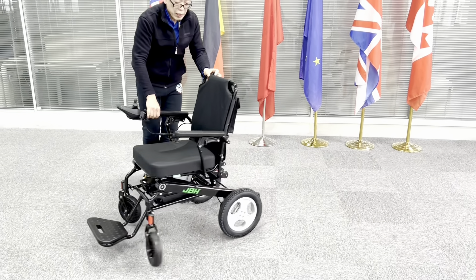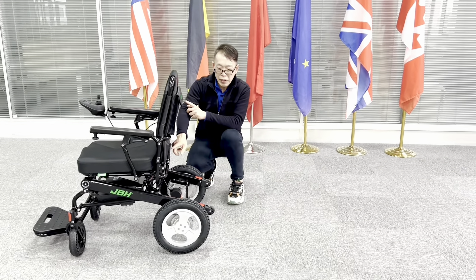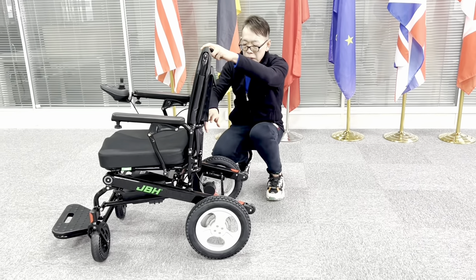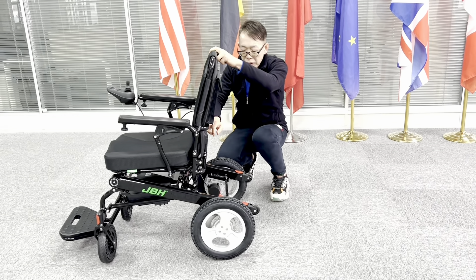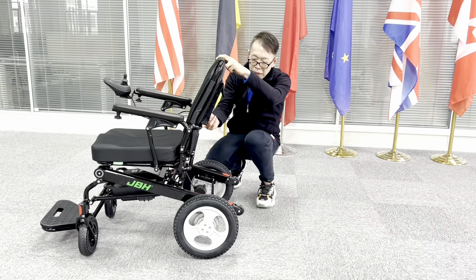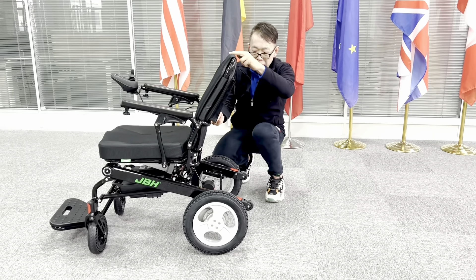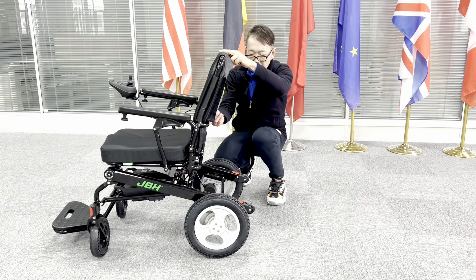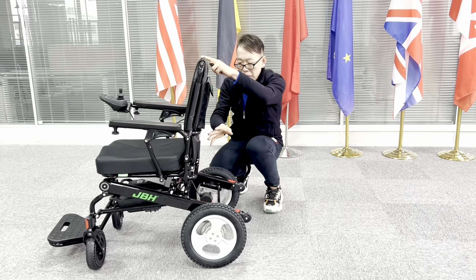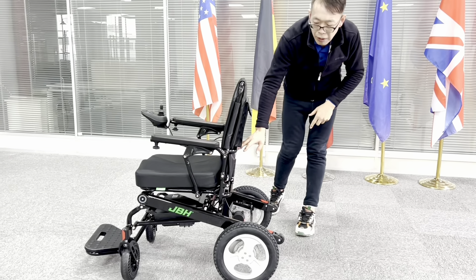This wheelchair has another feature — we have a gas lift here for you to adjust the backrest angle continuously. You can stop anywhere you want. Simply just pull up the lever here and then it automatically reclines back. You can stop at many angles by just lifting your fingers from the lever.